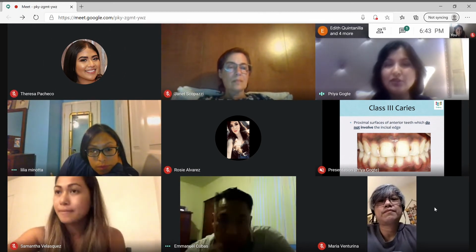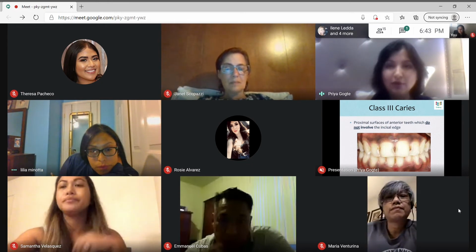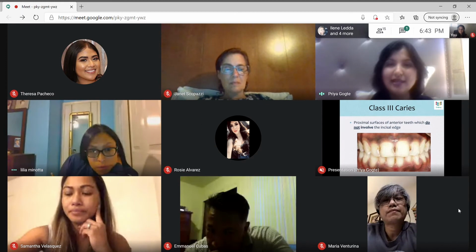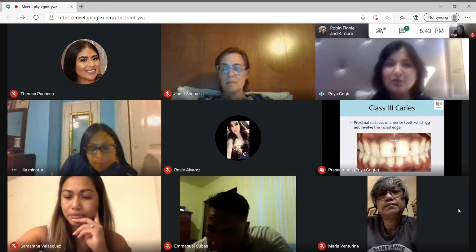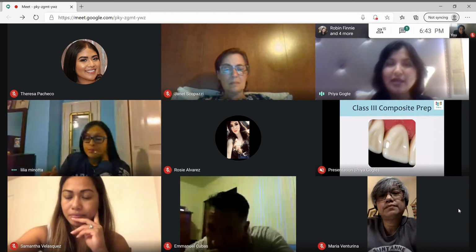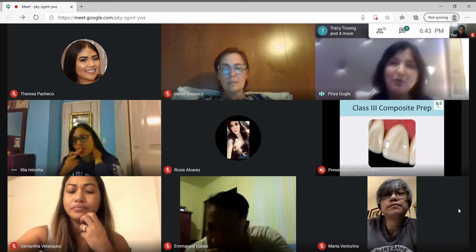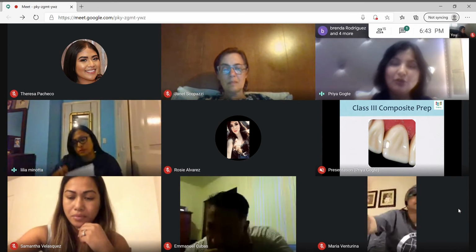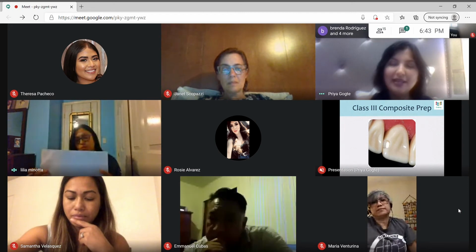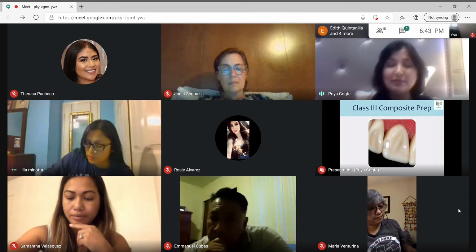So sometimes you are trying to do a class 3, but it changes into a class 4. You cannot predict those things. Dentistry is fun in that manner that we cannot predict everything. So right here is a class 3 composite prep. It is an ideal prep. It's on typodont and it looks nice and everything. Clinically, a lot of times things don't go in this manner.